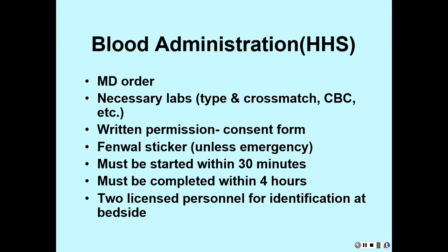So you've got some time frames there to be concerned about. And then you also need 2 licensed people to identify all your stuff, your blood and your patient and all that business, and that has to be done at the bedside. Okay.